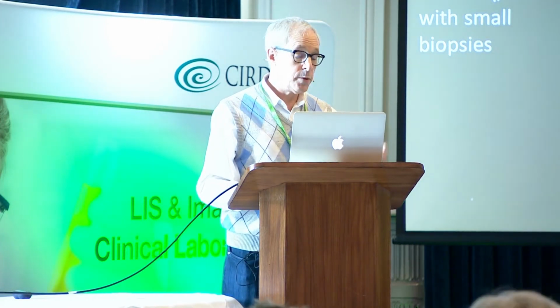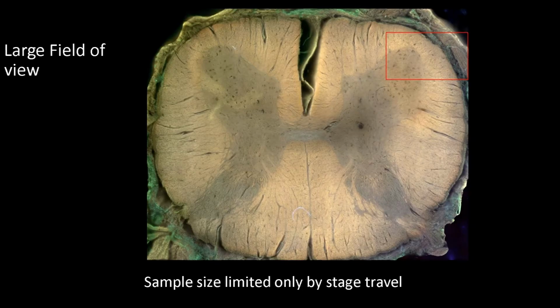The other nice thing about MUSE, as I mentioned already, is that it can image large fields of view. So here is a look at a whole spinal cord from an unfortunate youth in a car accident. It's multiple fields stitched together, and you can see it stitches nicely. If you zoom in, you can see a close-up of the motor neurons. This blue stuff here is the leptomeninges, and although you can't see it very well here, this is a peripheral nerve, and you can actually see the nodes of Ranvier longitudinally down the individual nerve fibers.